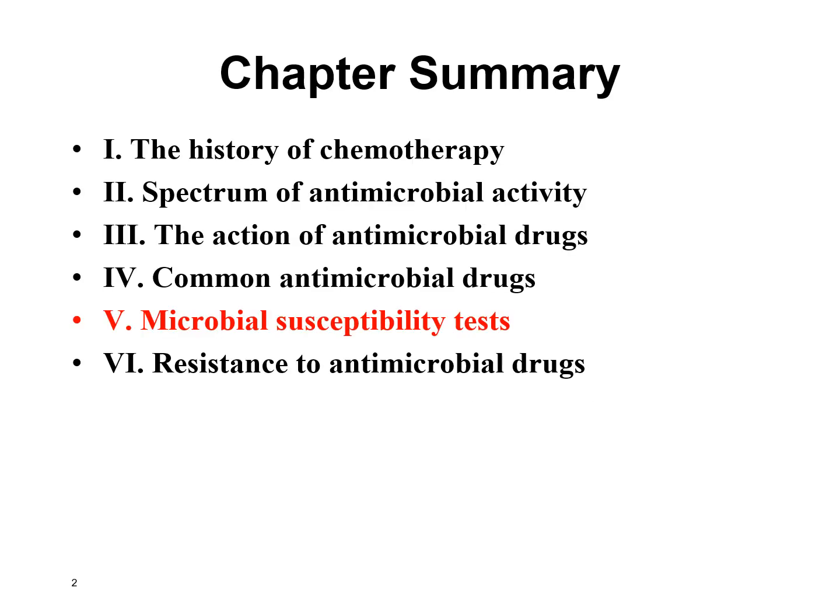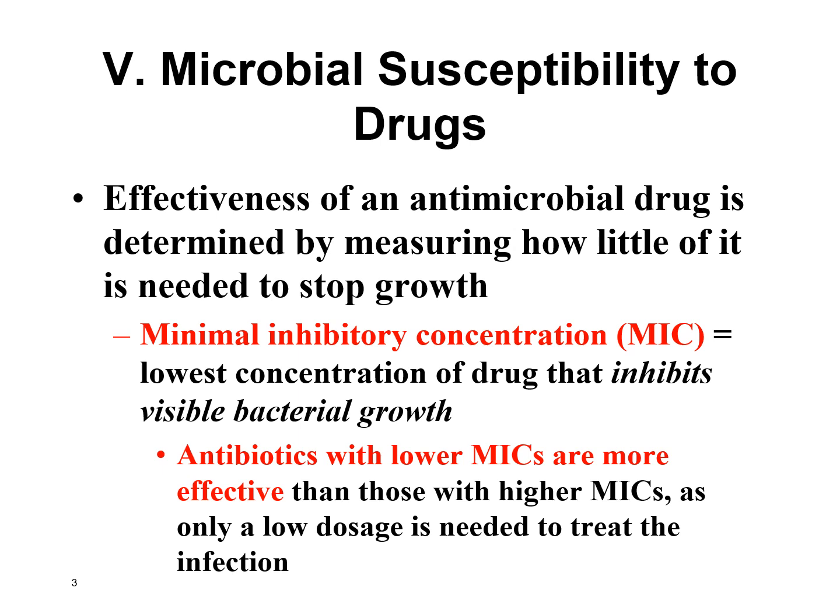We're going to take a look at how we tell which antibiotic to choose to treat our patient with. So this is a really important concept, the MIC, which stands for minimal inhibitory concentration. This is just the lowest concentration of the antibiotic that will inhibit the growth of the bacteria. So we want to be above the MIC level at the site of the infection, and that will be able to treat the infection.